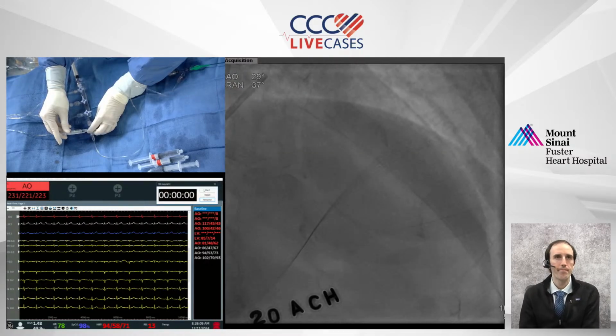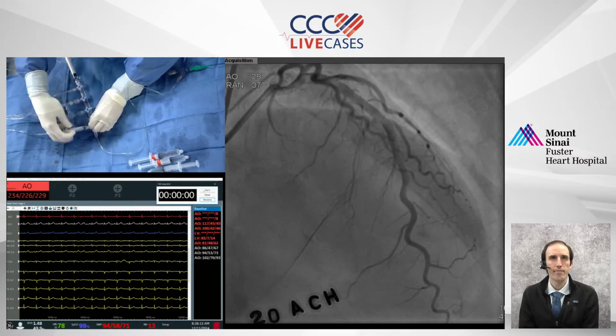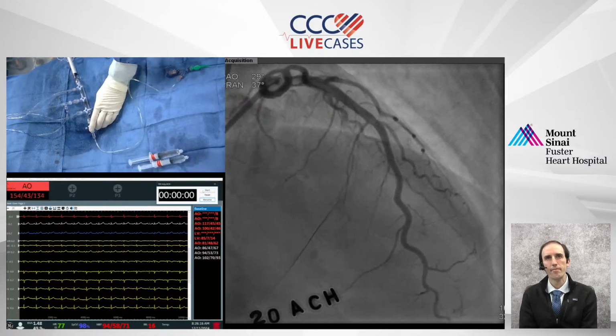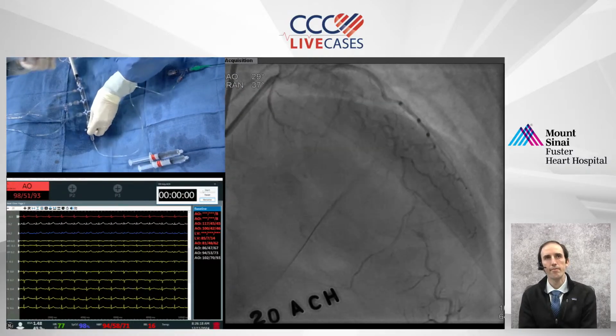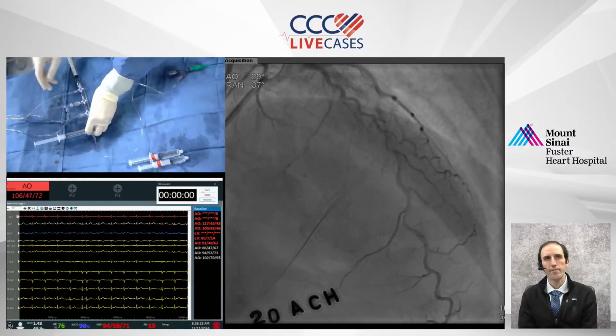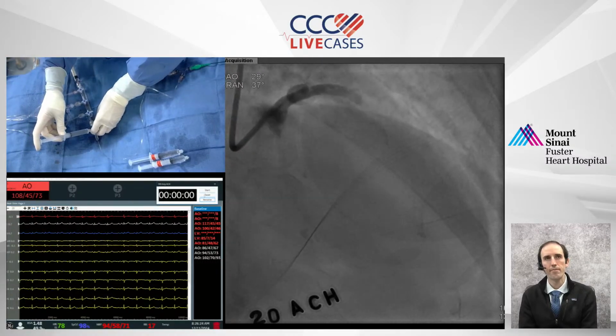Absolutely. So Joe, tell us a bit about the diagnosis of coronary spasm by acetylcholine versus endothelial dysfunction, angiographically speaking. So what's interesting, let me just infuse this. You can get an EKG.